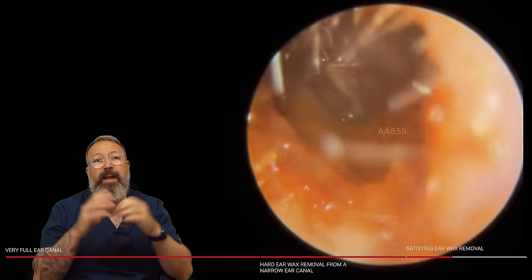So the second ear canal here — just pulling this out. It's got a little bit stuck. There we go — it's on its way now. Quite a soft wax material around the outside edge, with a hard nugget and then very soft material in there as well. There we go — you can see the eardrum on that side; it doesn't look quite as yellow. So I would say there's a little bit of middle-ear effusion on that side.